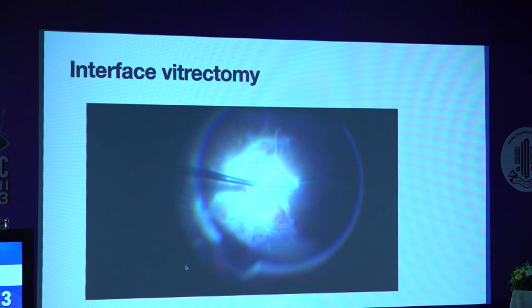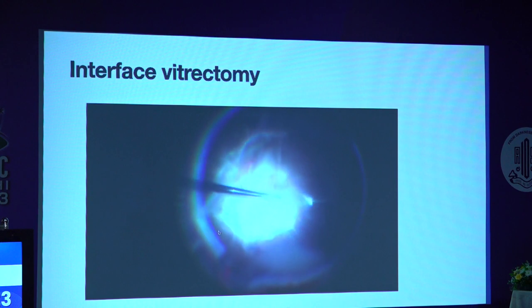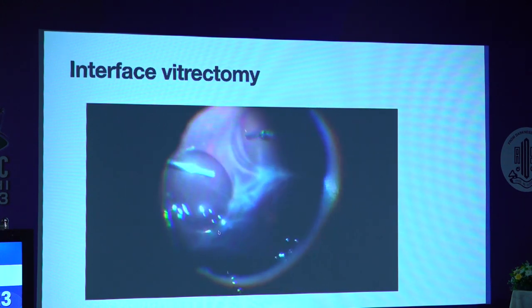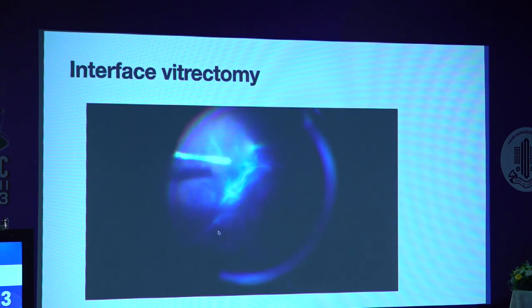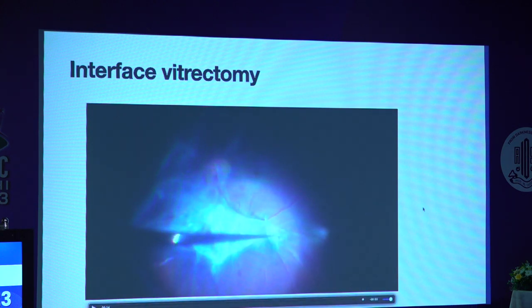They will not be needed for this proportional reflux and visco dissection. Sometimes during the bleeding, if you do an interface vitrectomy, you'll again find the right planes to help visualize the vitreous. As you can see, the vitreous gets highlighted like this when you work under air, and you realize that is an area where vitreous is left behind, and you can do more vitrectomy at that place. So in between, during surgery, if you switch to air, that will help you identify the planes in surgery.